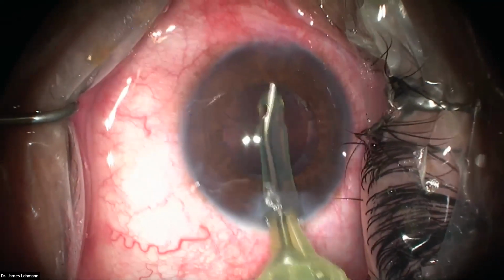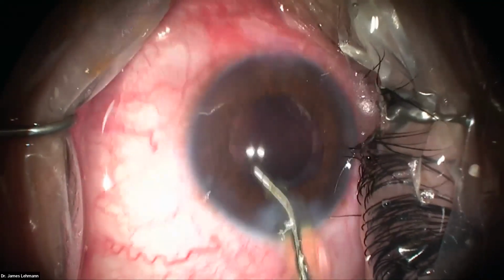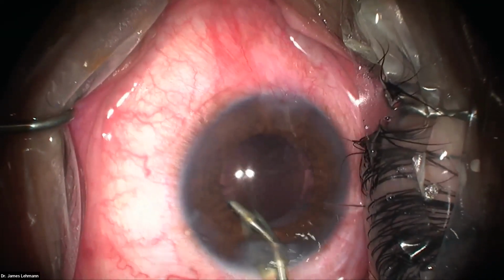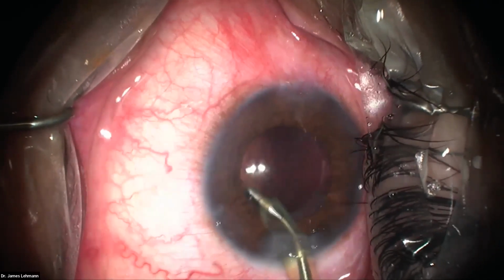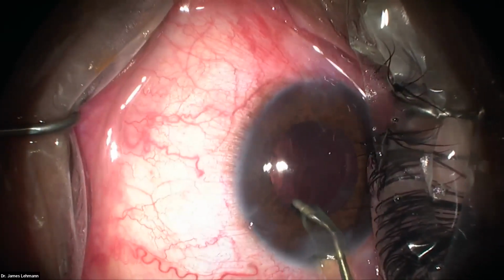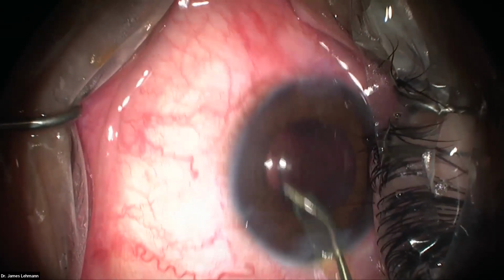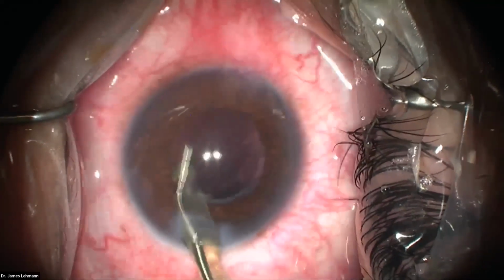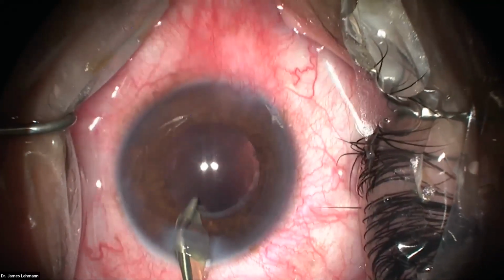This is a little more sticky capsule. So let's do what I talked about. Maybe let's try to get the subincisional stuff first. Sometimes people have real sticky cortex. There we go. Bring it up a little bit.